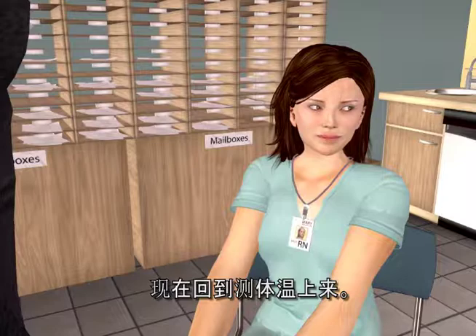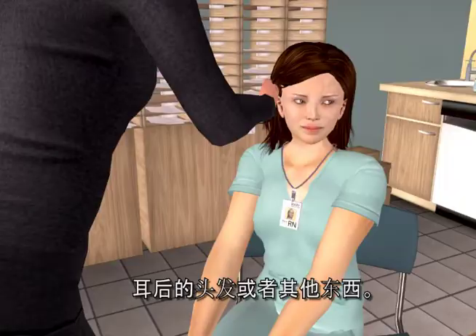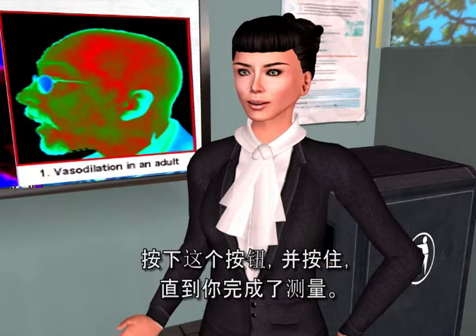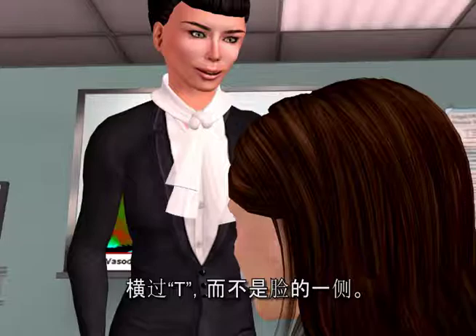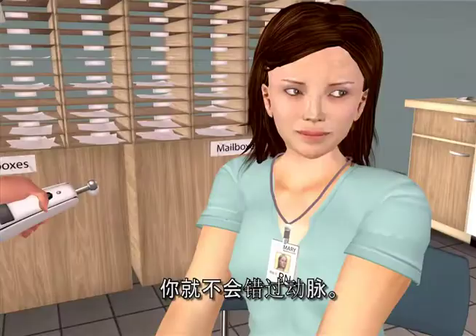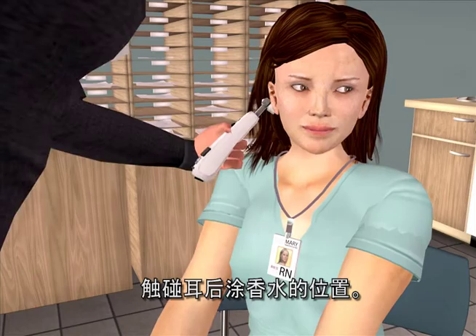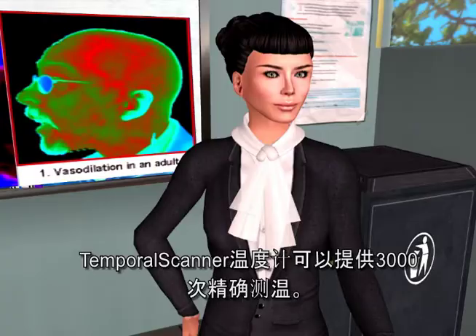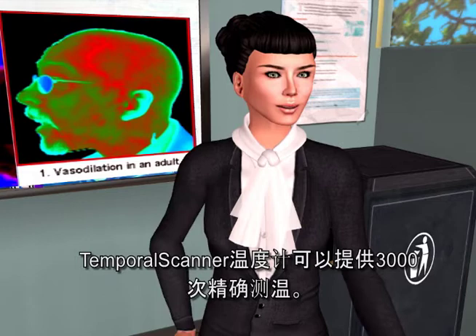After wiping the probe head, brush away any hair or anything else that might be covering the forehead or the ear. With the probe flush on the forehead, depress the button and keep it depressed until you are done. Slide straight across the forehead, crossing the T's, not down the side of the face. Continue to hold the button down, touch the neck behind the earlobe — the perfume spot. Now let go of the button and read the temperature. The temporal scanner pinpoints the highest of 3,000 temperatures to provide the most accurate temperature possible.